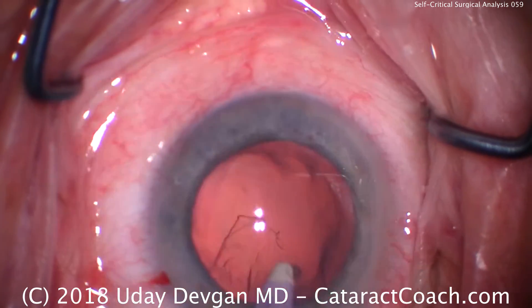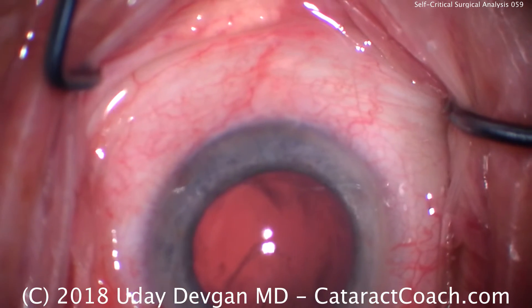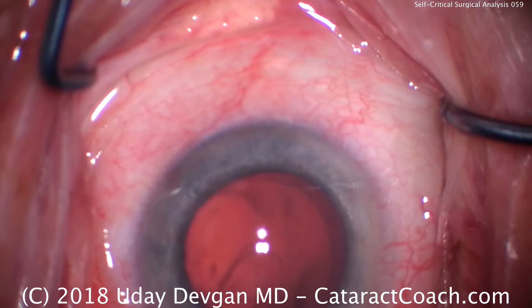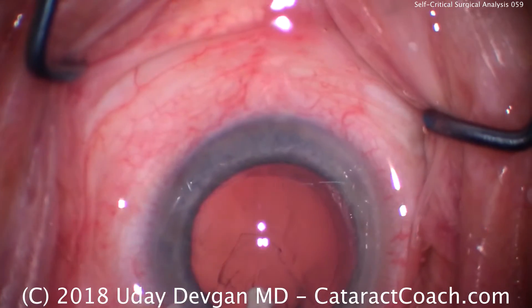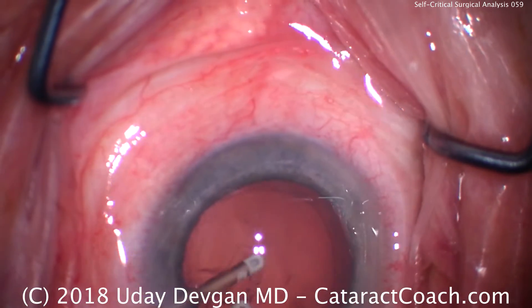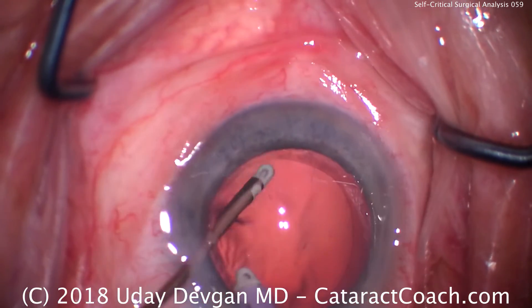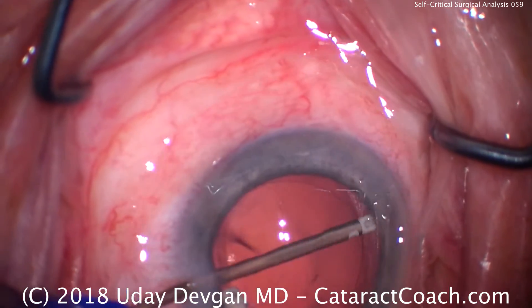Now subincisional — I'm having a hard time grabbing for it. In this case we're using this transformer IA tip. This is a neat invention; I wish it was my invention, it's that good. Now we can split it and use a bimanual approach: irrigation with the right hand, aspiration with the left, and we can remove that. Clean up the undersurface of the anterior capsular rim as well.